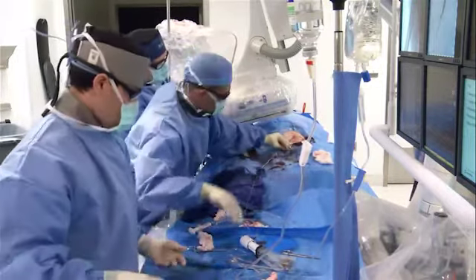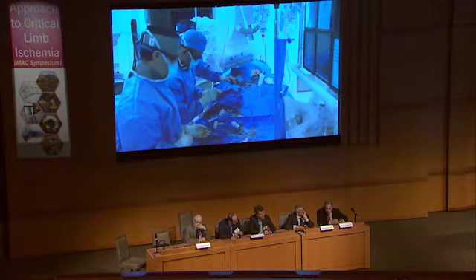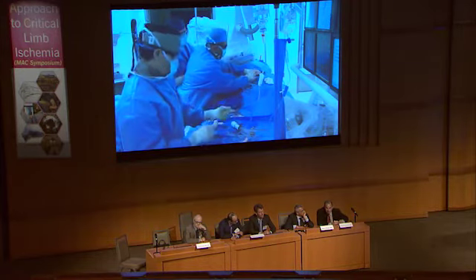Mehdi, at the end of this case, you're going to have to remove that contralateral sheath, too. And I'd be really careful with that. I've seen even braided sheaths separate. By taking precautions ahead of time, by putting, for instance, a balloon that you can put distal and help to pull it back, you can salvage that situation. Yes, because I've seen these clearly snap in the past.